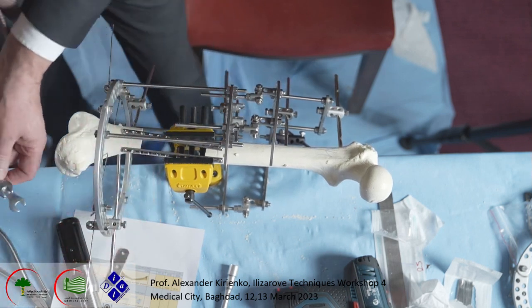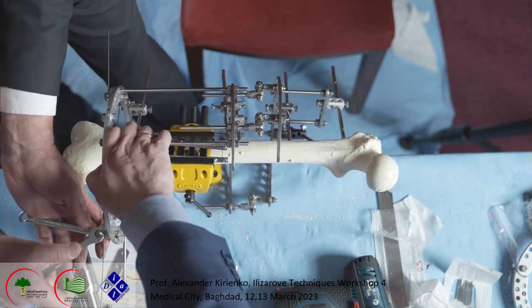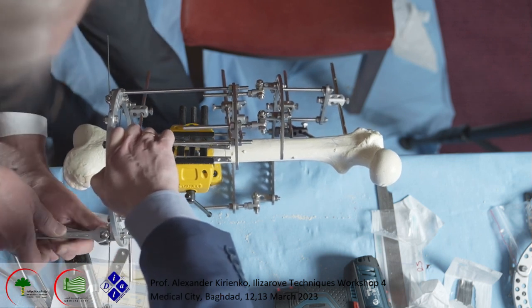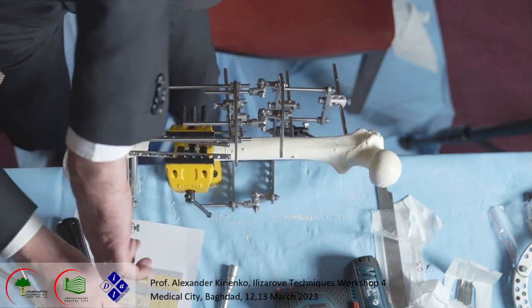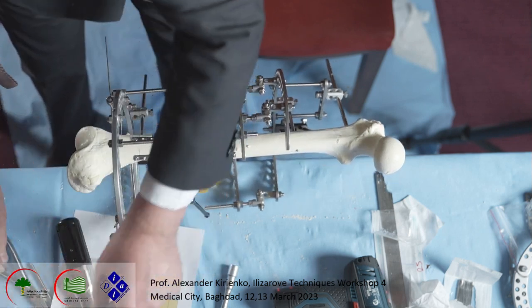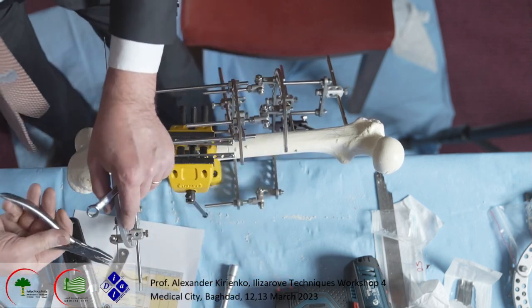Okay, try this. Try this. Okay, do the classical way, cut, bend.